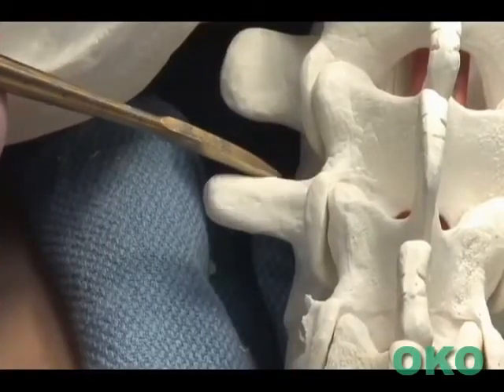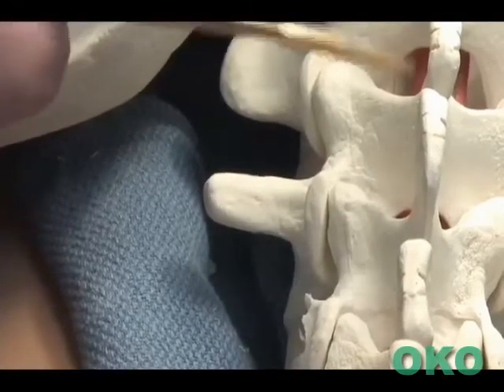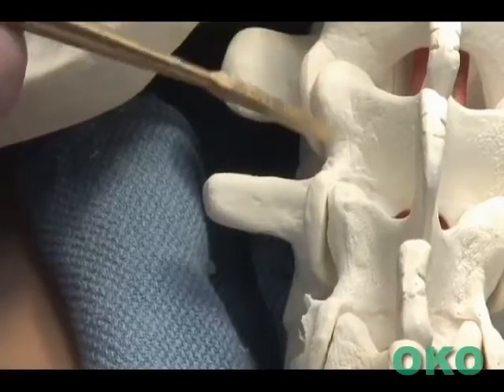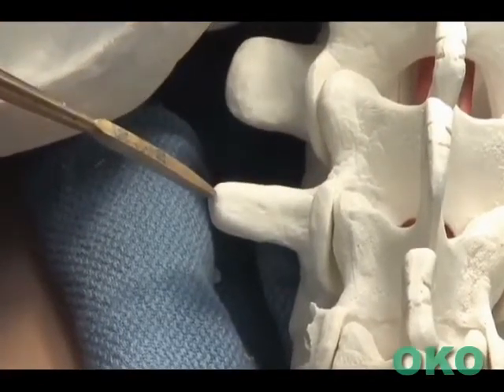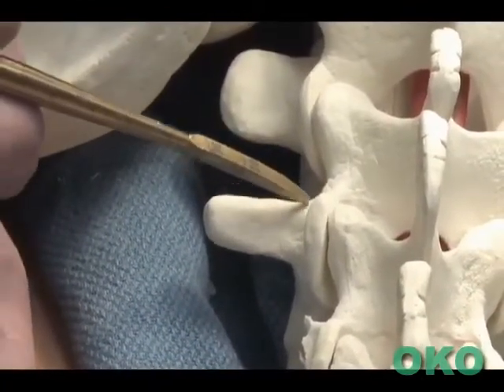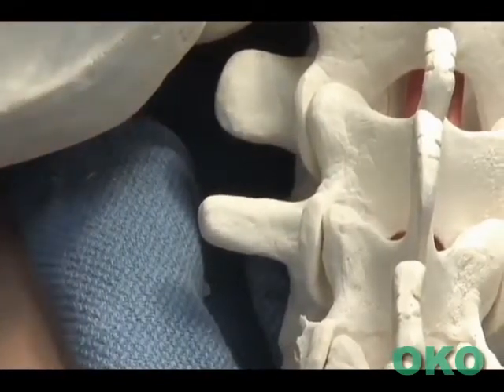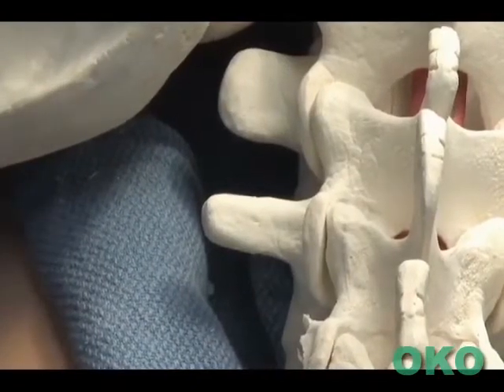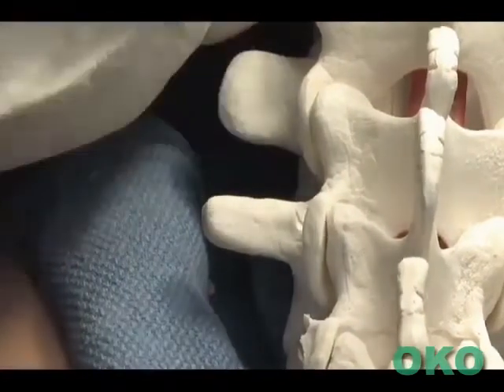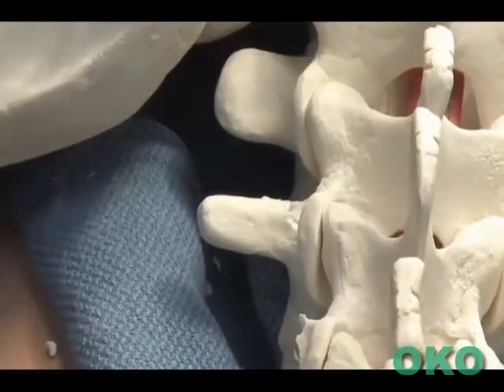We will now demonstrate the application of a lumbar pedicle screw after subperiosteal dissection and exposure of the anatomic landmarks, such as the lateral border of the pars, the transverse process, and the superior and inferior articular process of the facet joint. Noting the line that intersects the center of the transverse process and the lateral border of the facet joint as an anatomic starting point, often denoted by the mammillary process, can be decorticated using a 3.5mm burr or a ronger.